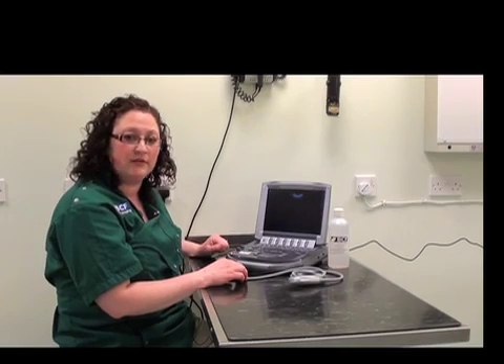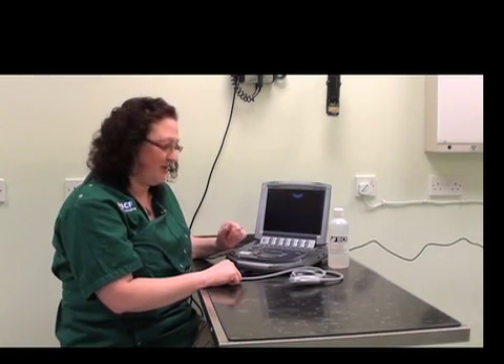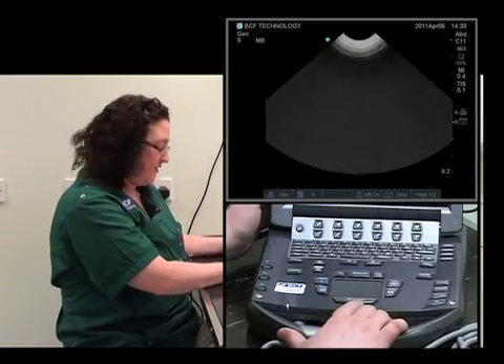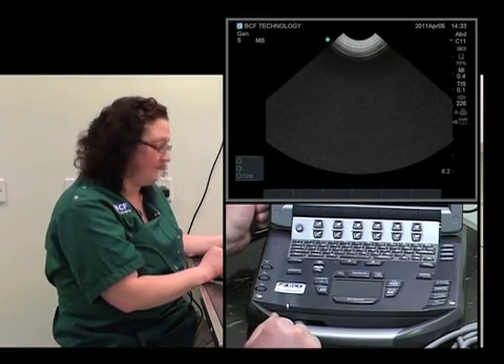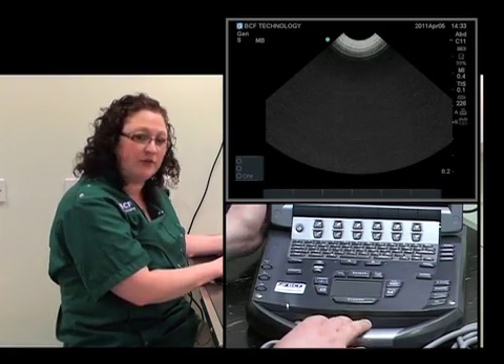On some machines, the time gain compensation controls are a set of sliding buttons. Because this is quite a portable machine, they've made them as two buttons instead. Another important button to note before we get started is the freeze button. This allows you to stop the image and scroll back a few frames to get the best image of what you're trying to look at. On this machine, it's located right underneath the touchpad. After freezing, you can save the image, make annotations, take measurements, and more.